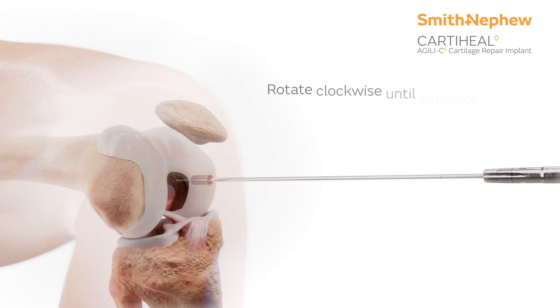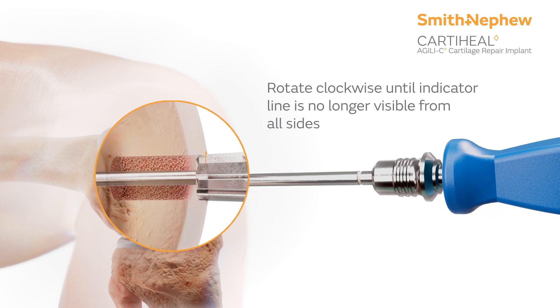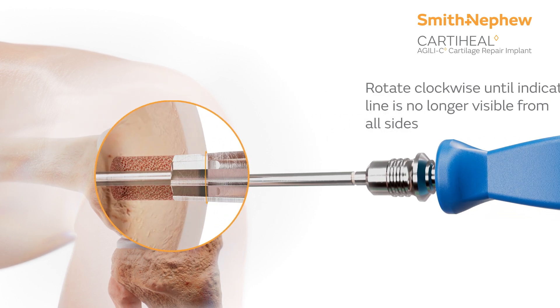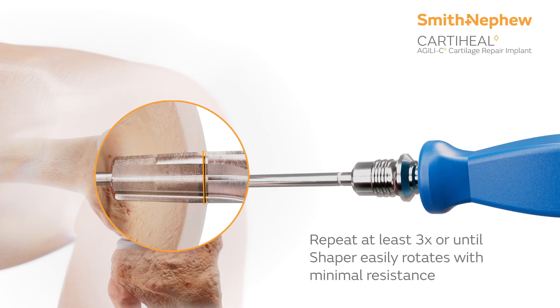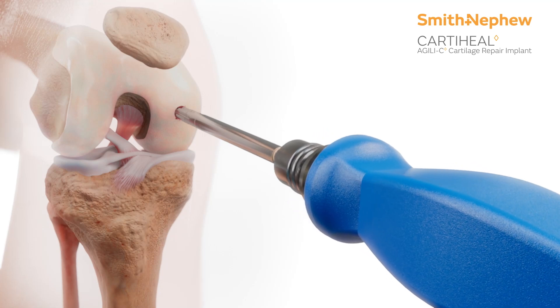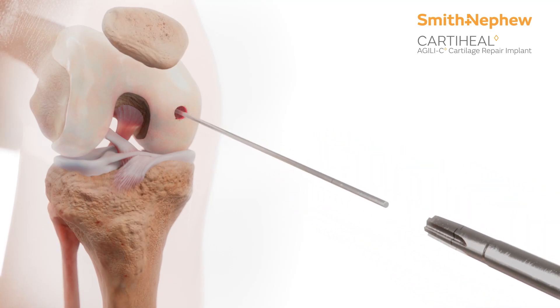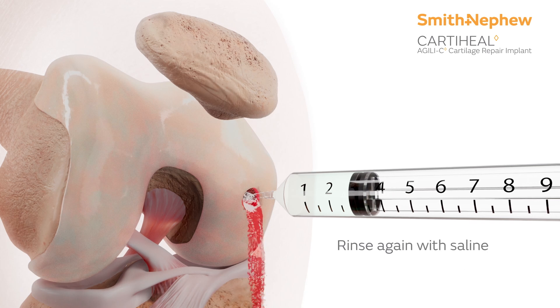Rinse the site with saline to flush out any debris. Next, insert the shaper over the K-wire and manually rotate clockwise until the indicator line is no longer visible from all sides. Repeat this step three times. Then, remove the shaper and the K-wire and rinse again with saline.